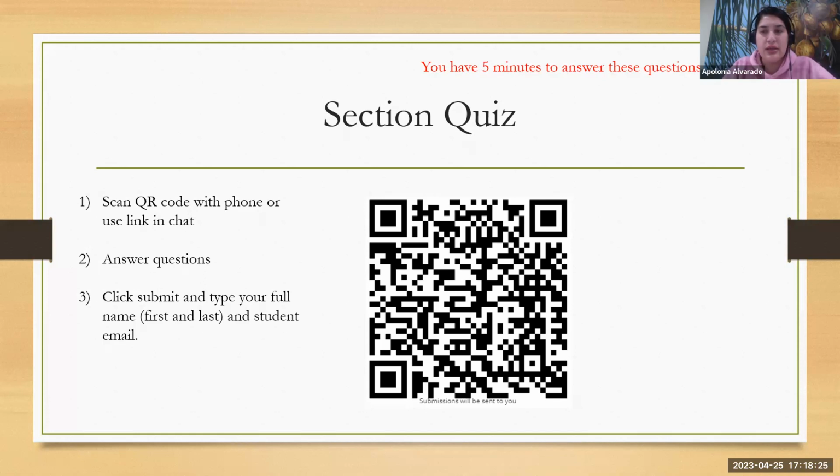You have to communicate with your patient, because if they're dying in the scanner and we don't know it, we have to be able to say, "Are you doing okay, Mr. Smith?" And if they say yes, I'm doing fine, then we know they're doing okay. But we have to be able to communicate. Legally, we have to have some line of communication with them. We give them a panic ball, and then we have to talk to them, communicate. Some sites actually write you up if you don't communicate.